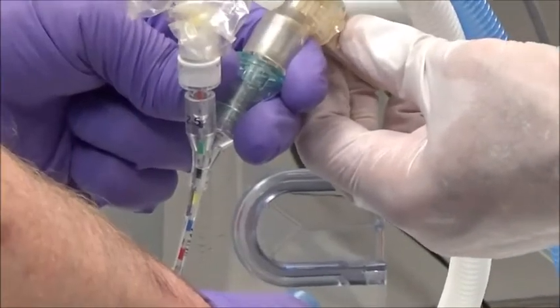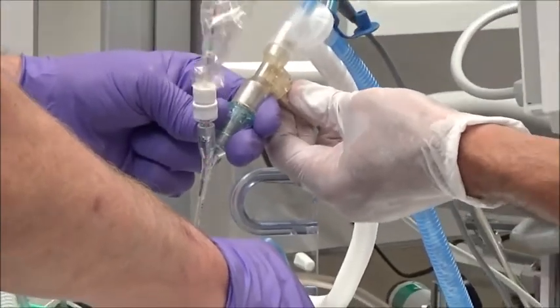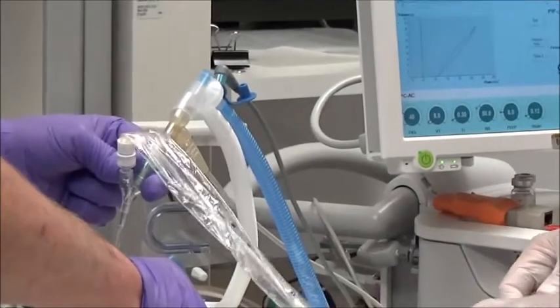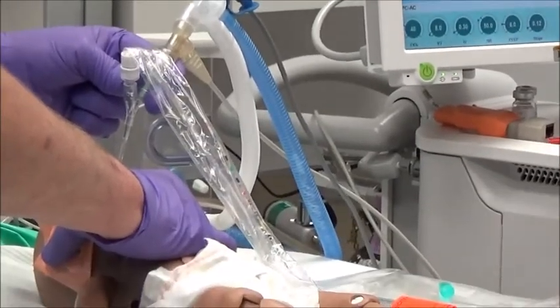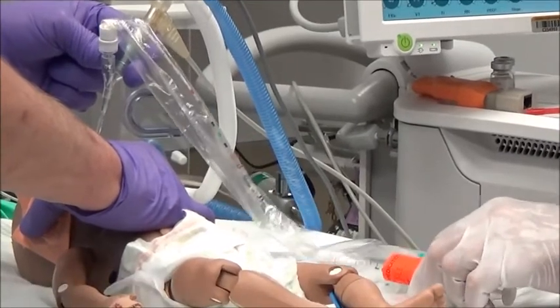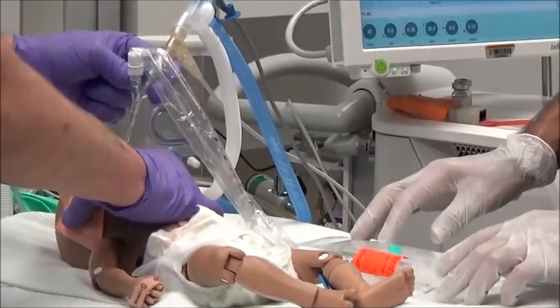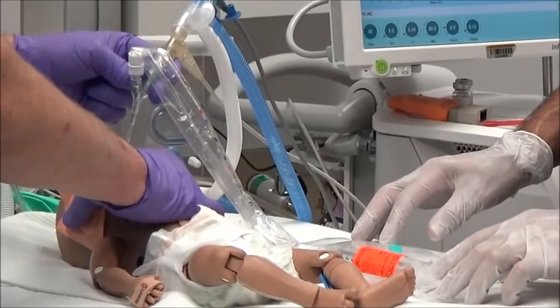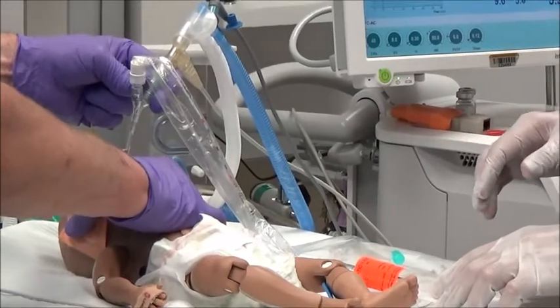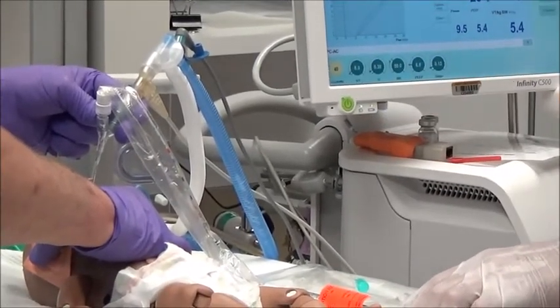Deliver the first aliquot over two to three seconds, then promptly remove the MAC once the medication is delivered. Remember that the catheter will cause a partial to full blockage of the endotracheal tube, resulting in reduced ventilation. Assess the baby and ventilation. The FiO2 may need to be increased to maintain oxygen saturations between 90 to 95%.